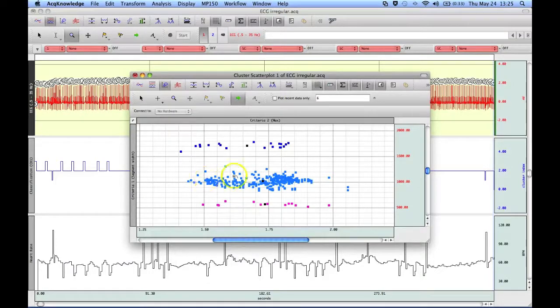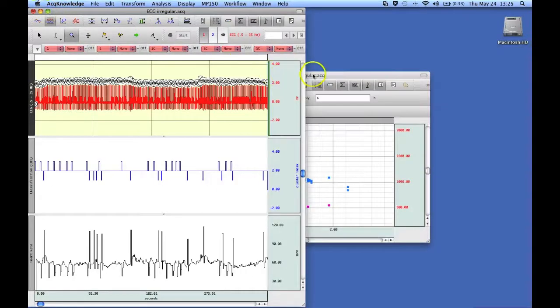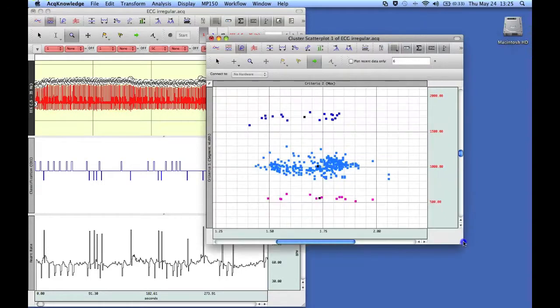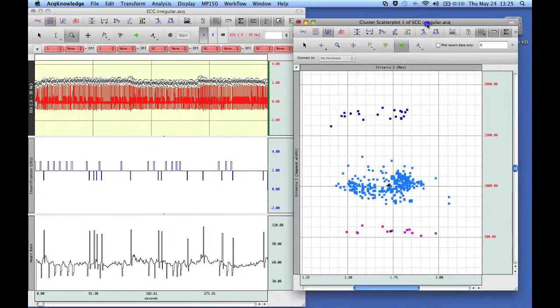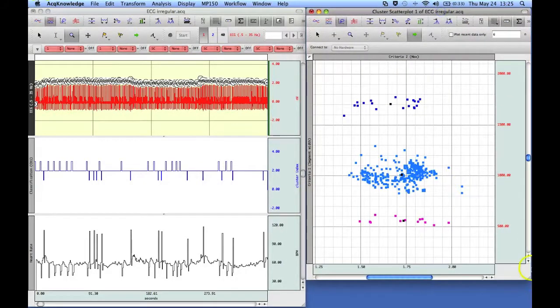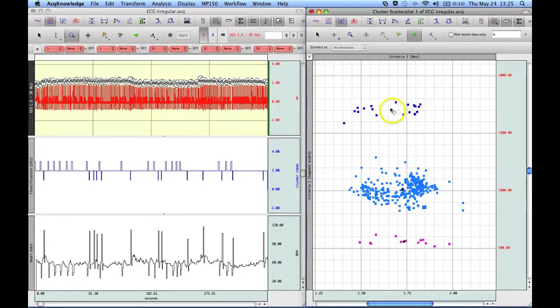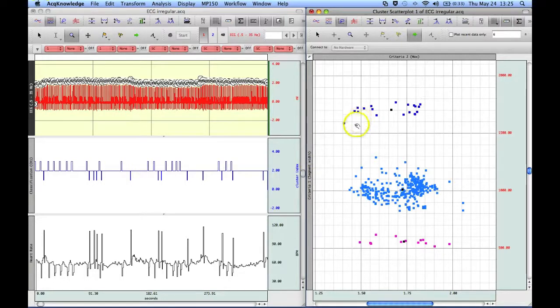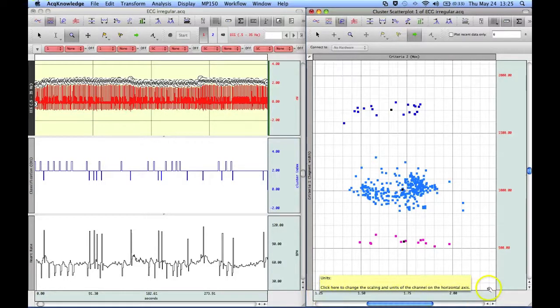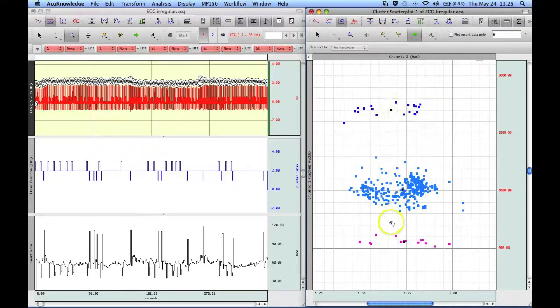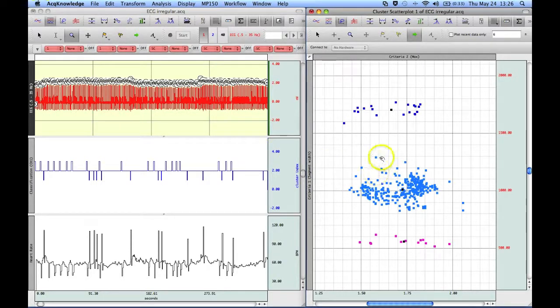Now, what the software has done is created this new plot. And if I resize my windows, I can have a better look. Okay, so on the right, we now have our data plotted into three groups. The amplitude of the R wave is running across the bottom. So we can see one and a quarter millivolts up to two and a quarter millivolts. And then the width of the interval or segment width in the opposite direction. One of the nice things about the software is that we have this jump tool. So we can select an event over here and it will jump us to that point in the data.